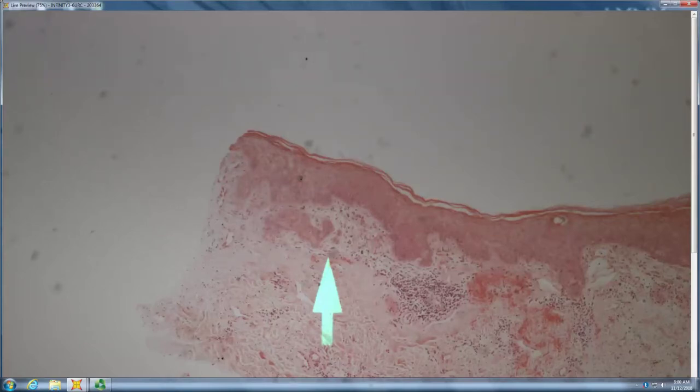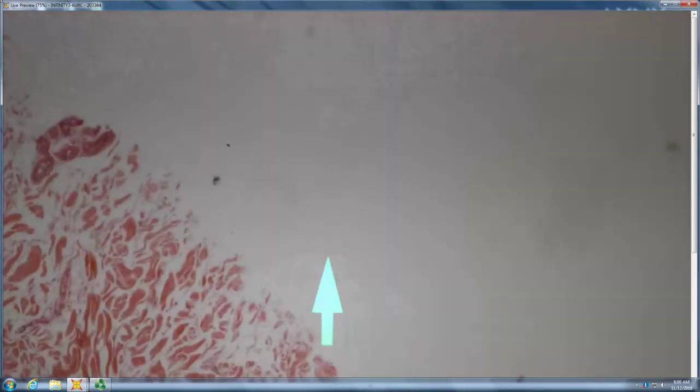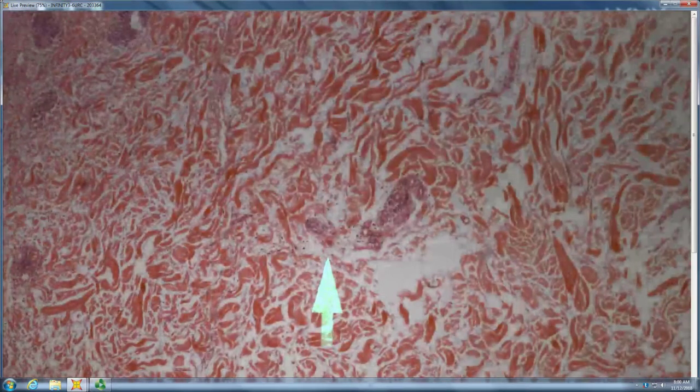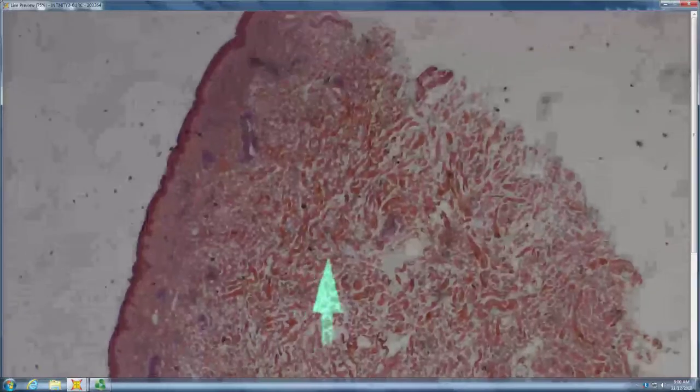Anyone staining with CD123? So if it's still inflammatory, either hypertrophic LE or a hypertrophic LP, there are a ton of CD123 cells all around it. They disappear when it becomes squamous cell carcinoma. So that's really helpful to differentiate, and it really can be tricky, where you may have to do that. And the squames that arise in there are not friendly squames. They're very, very nasty squames, so you really want to know.